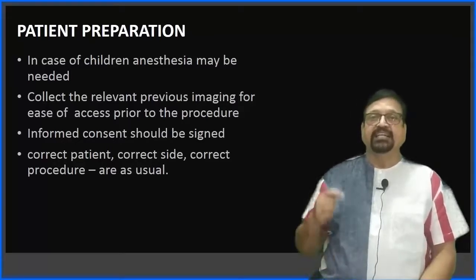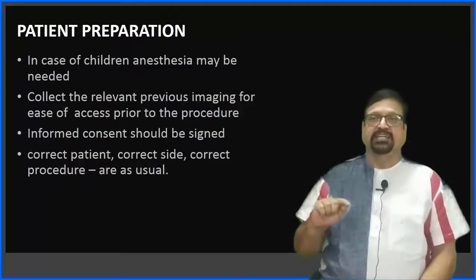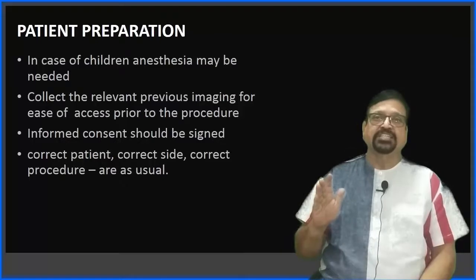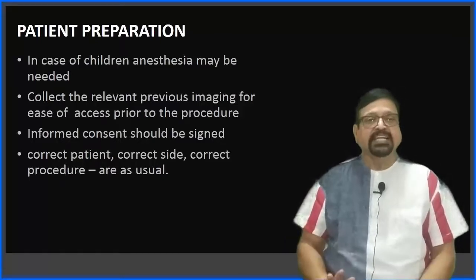Then collect the relevant previous imaging for the assessment. All the earlier and relevant investigations have to be asked for from the patient. Informed consent is required.